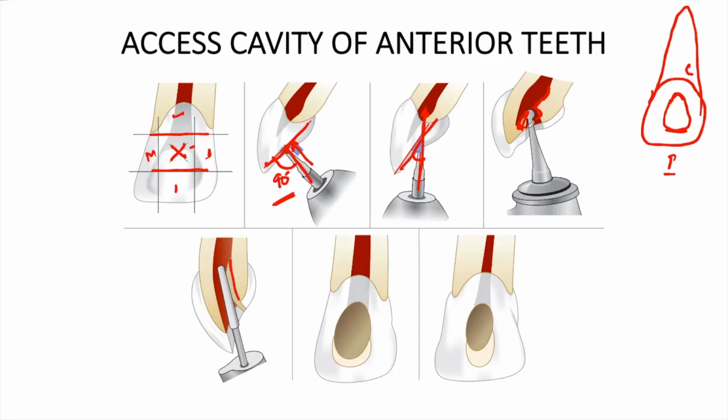So we gain entry into the chamber and remove the dentinal roof. After this, we remove the lingual shoulder using Gates Glidden drills and safe tip diamond or carbide burrs. By this we gain straight line access to the apical foramina. Fine. So this is how we gain access to the root canal system of anterior teeth.